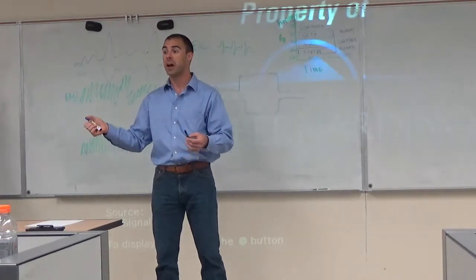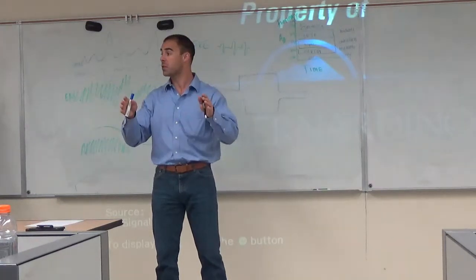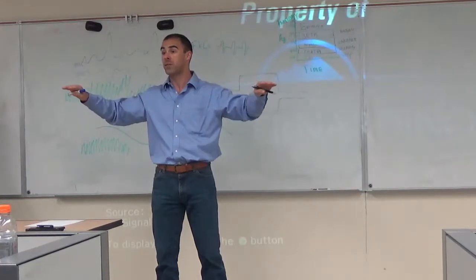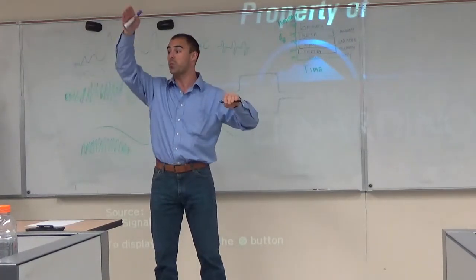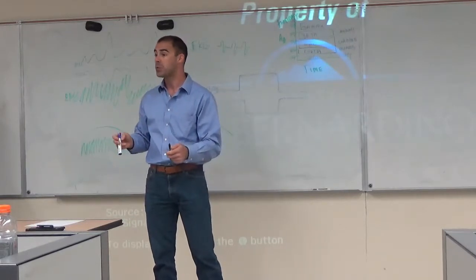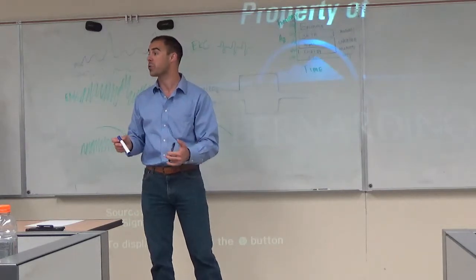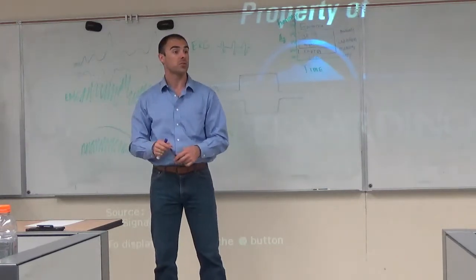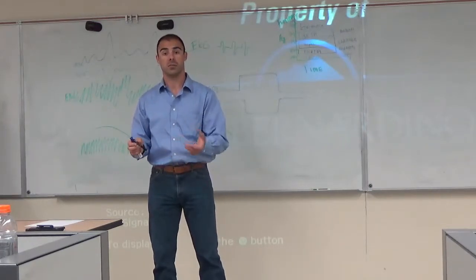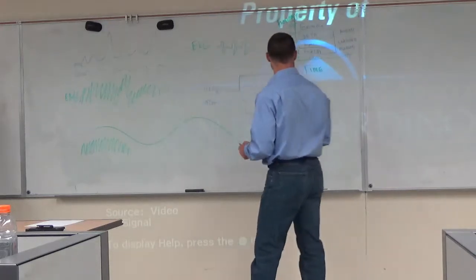If you have hundreds of trials, if you have enough trials, you can average them together, so that the noise will wash out over the averaging process, and you'll be left with whatever the neural signal is that's the same among all those trials that are averaged. But you need a lot of those trials in order to achieve that. And that's one of the reasons why we have so many trials, so that we can be well suited for dealing with that noise that's inherently big. Okay, so that's pretty good.